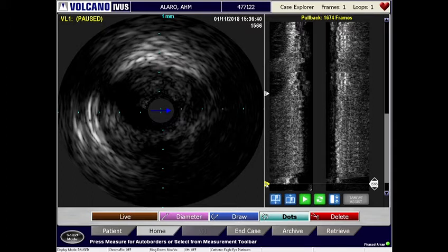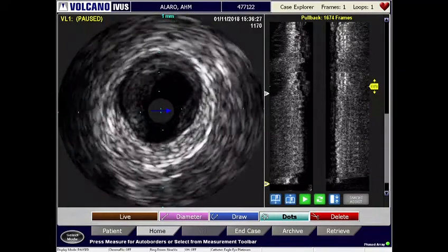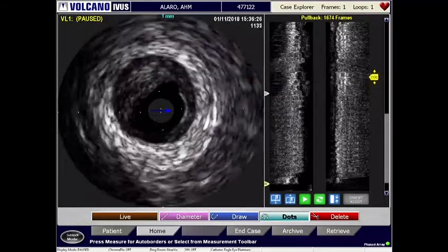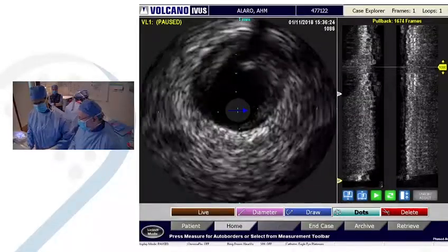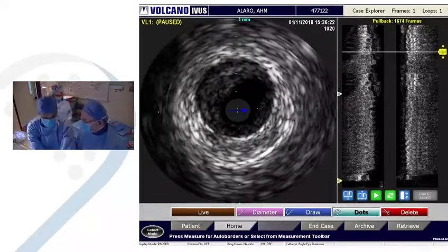So my personal way would be now first to put a stent in the proximal circ, because the circ ostium is free, I think. Yes. So we treat the lesion in the circ and then cover the left main towards the LAD, and hope to avoid ostial circumflex stenting.